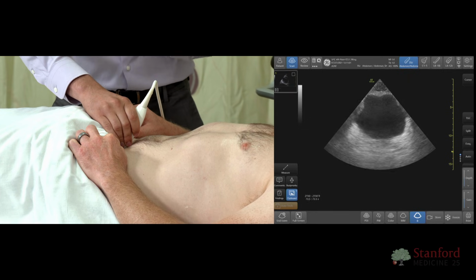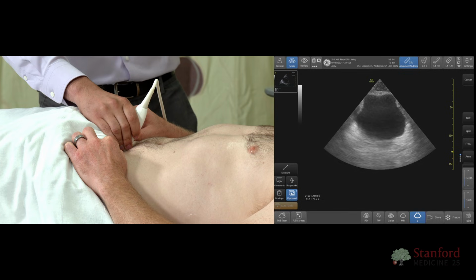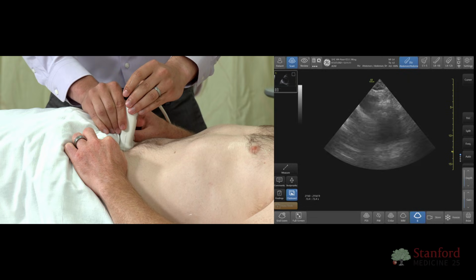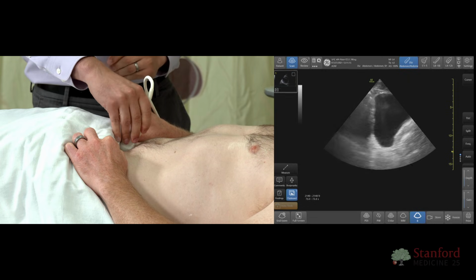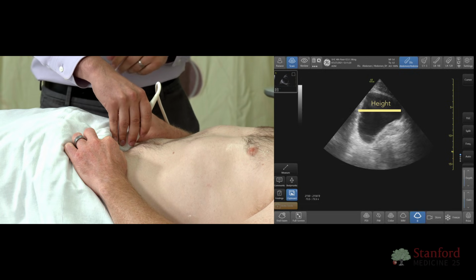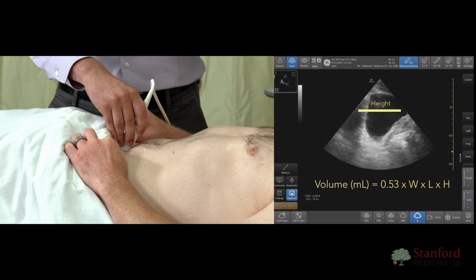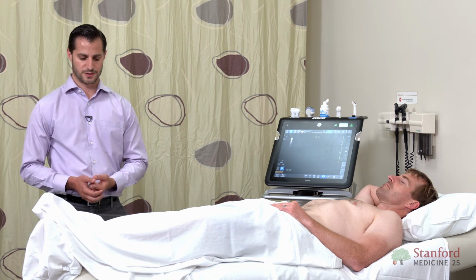If I wanted to do measurements of the bladder, there are several ways I can do it. I can measure the width as well as the length in this particular view. I can then rotate my probe about 90 degrees, so it's pointed towards the head. And from here, I can measure from the top of the bladder to the bottom, and that is its height. When we're thinking about the formula to actually measure bladder volume, it is 0.53 times the width times the length times the height.